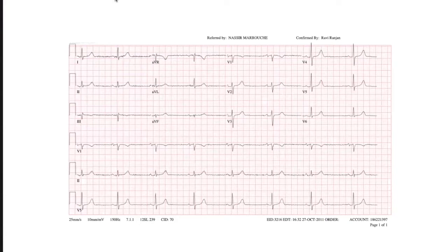Okay, Lindsay, will you circle some P waves? Or maybe, sorry, let's do heart rate first. Let's figure out what the heart rate is, and walk through your process of trying to figure this out. Nearly 7, so it'd be under 60 for the beats. And people can help her as well. You are correct that it's under 60.